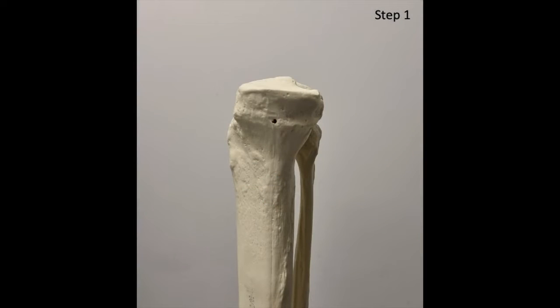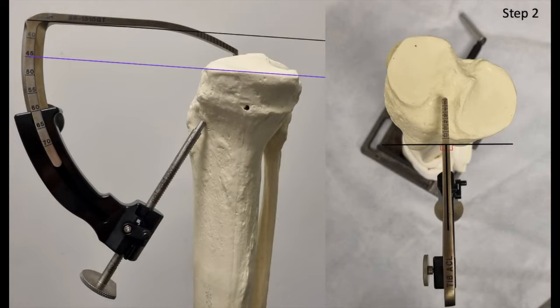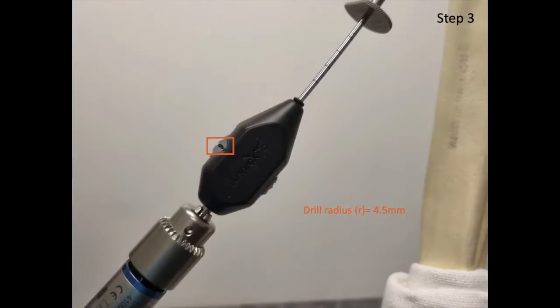The first step is to calculate the posterior tibial slope. The second step is to orient the intraarticular arm of the tibial drill guide parallel with the tibial plateau in the sagittal plane and perpendicular with the anterior medial cortex of the tibia in the axial plane. The third step is to determine the radius of the tibial tunnel by dividing the diameter of the planned tibial tunnel by 2.